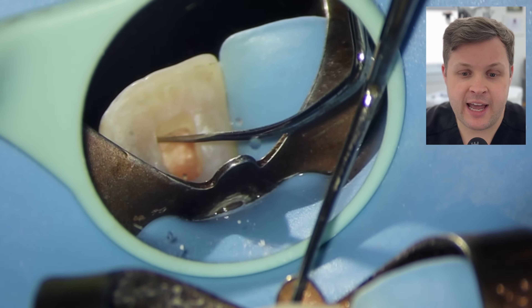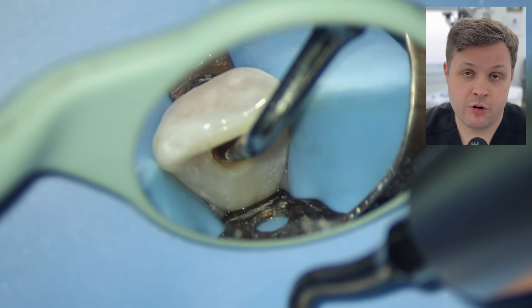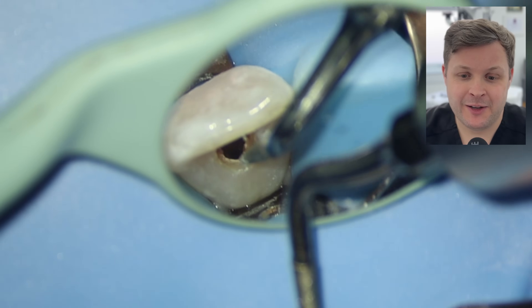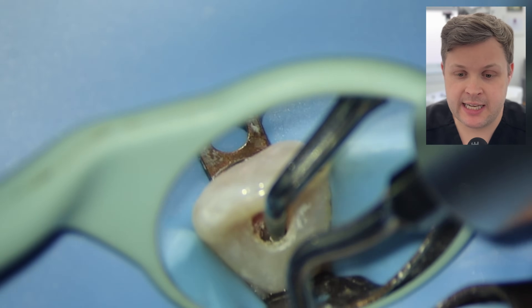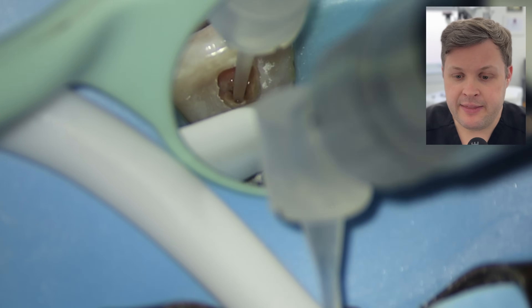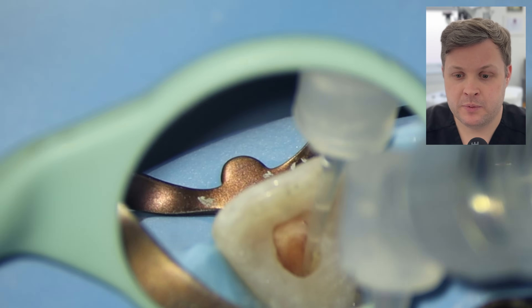I'm using a probe here just to check the undercut, and I can see that we've removed the undercut of the pulp horns. Once we've confirmed the pulp horns have been removed, the next thing to draw our attention to is the palatal shelf — the hump you get on the palatal aspect of the tooth. If you remove this, when you come to obturate the tooth later on it's going to make it much easier to see down the canal space. I'm using an ultrasonic tip — you could use a fast handpiece but that's super risky. Because I'm concerned about the remaining pulp tissue, I'm going to use a lot of hypochlorite and activate it quite early to dissolve this pulp as quickly as possible.